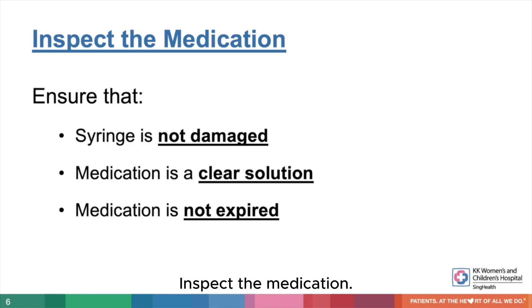Inspect the medication: ensure that the syringe is not damaged, the medication is a clear solution, and that it is not expired. If it is damaged or expired, please use another injection.